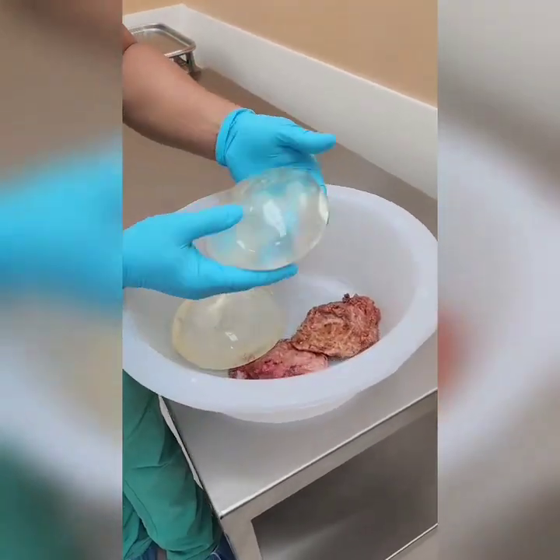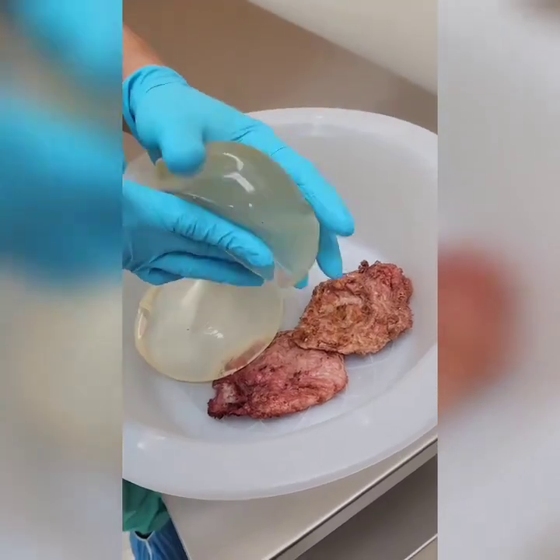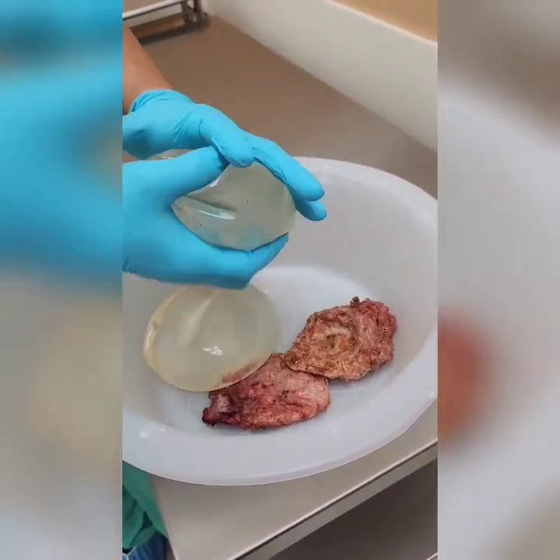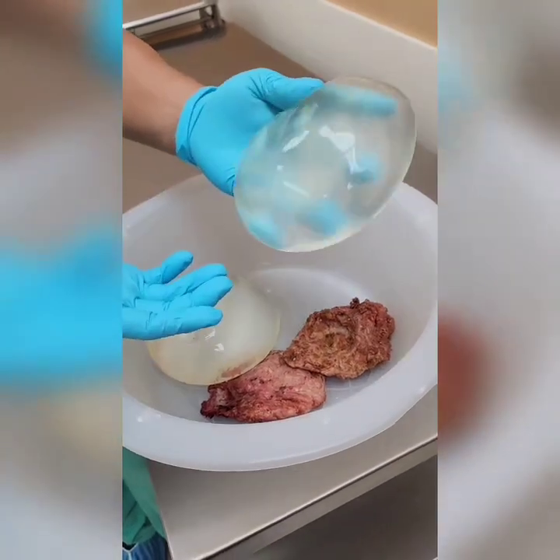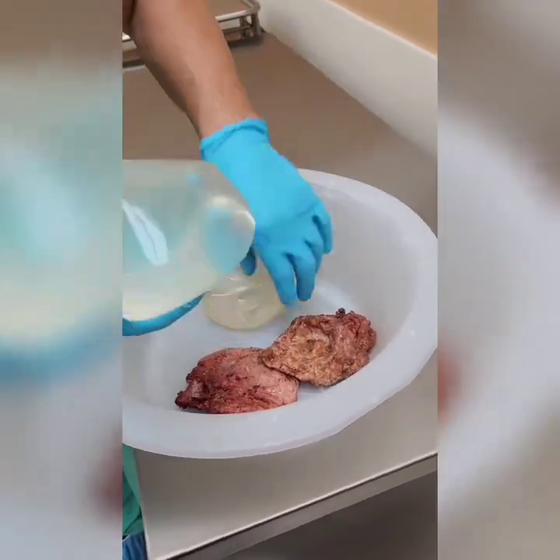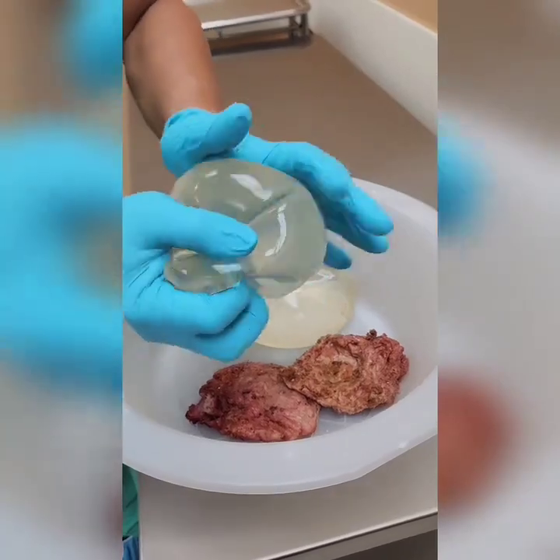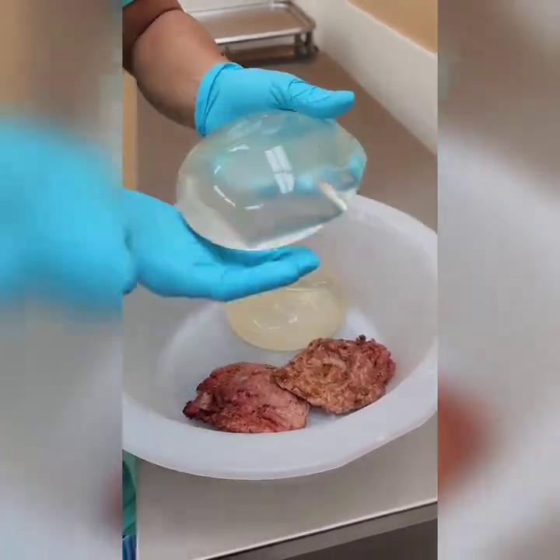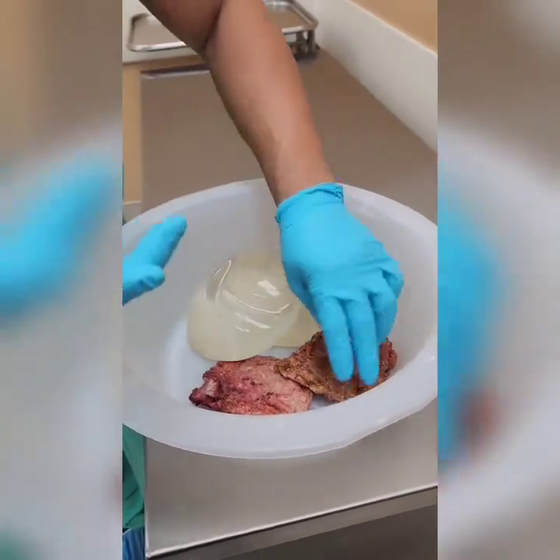And exchange of implants, and notice these implants are brand new looking, so the capsular contracture really doesn't have anything to do with the implant function itself. It's just really that membrane that your body forms around it. Let's look at the capsule.